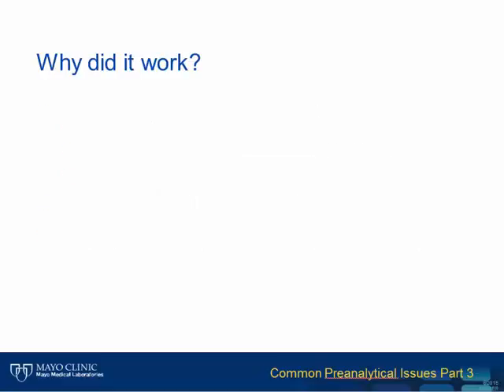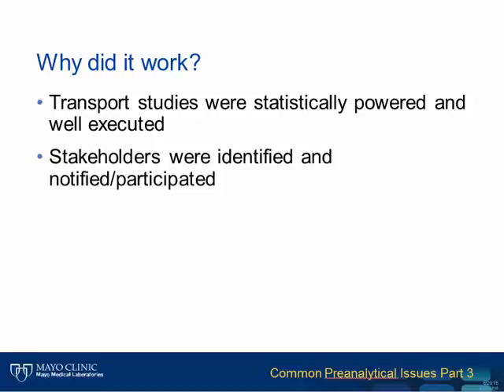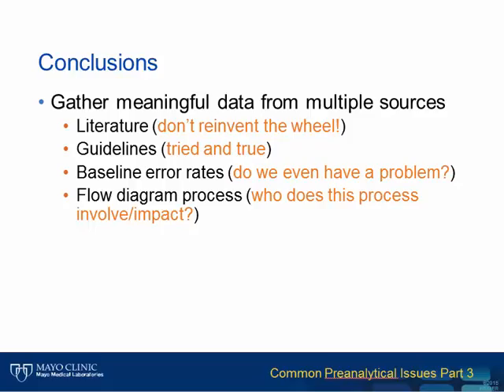I think this implementation and process improvement worked in a predictable fashion because the transport studies that were done to choose the best container were statistically powered and well executed. Additionally, the stakeholders were engaged in the process and notified as decisions were made.